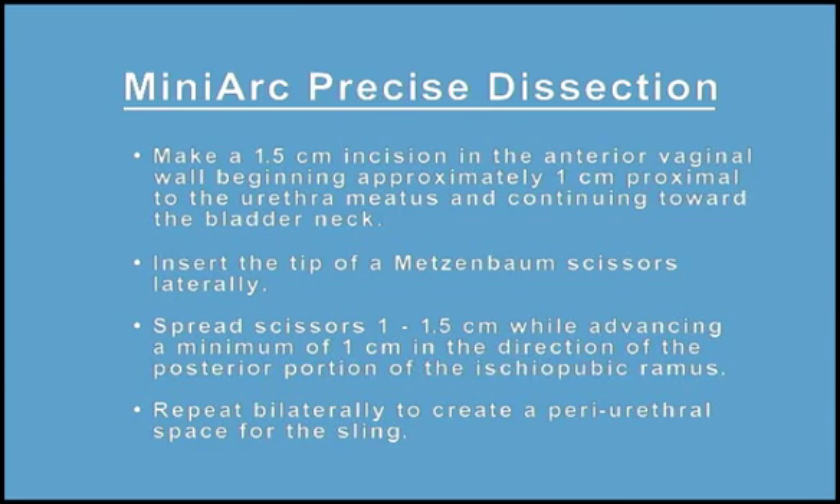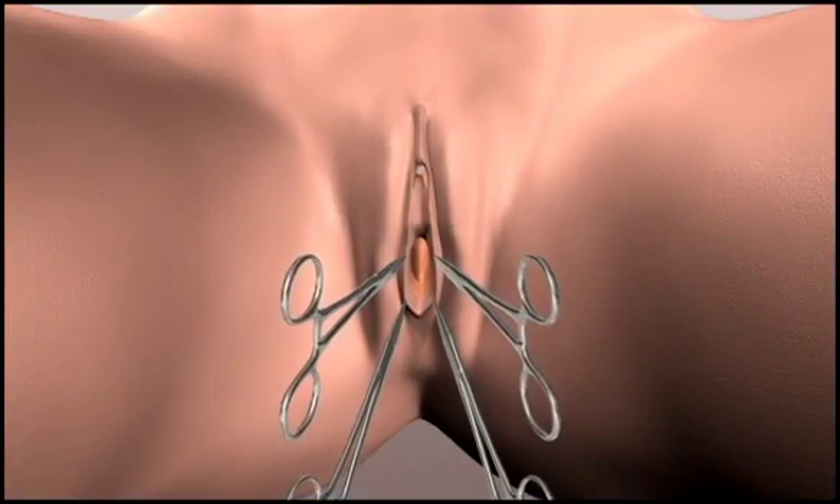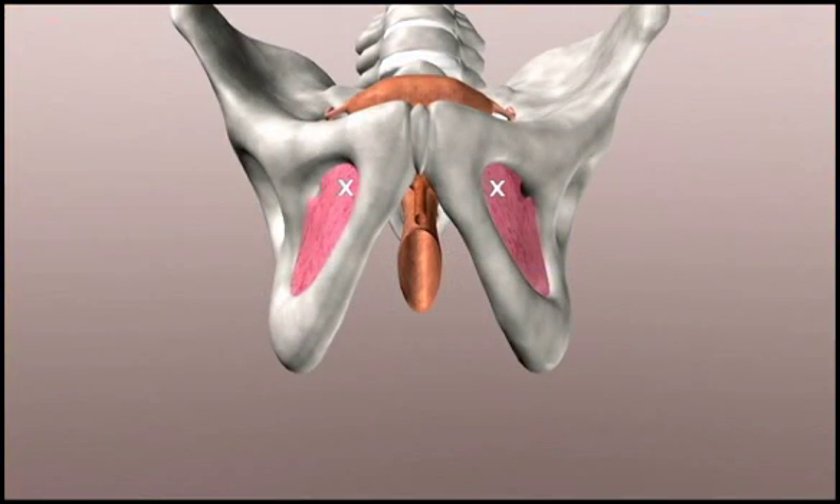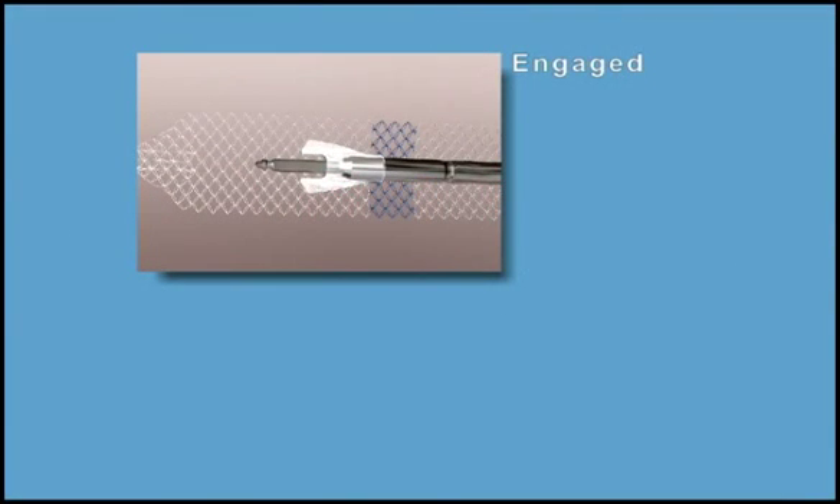Repeat bilaterally to create periurethral space for the sling. For sling placement, locate and mark the area just below the adductor longus tendon, lateral to the inferior pubic ramus. Needle insertion should be aimed in the direction of this mark.